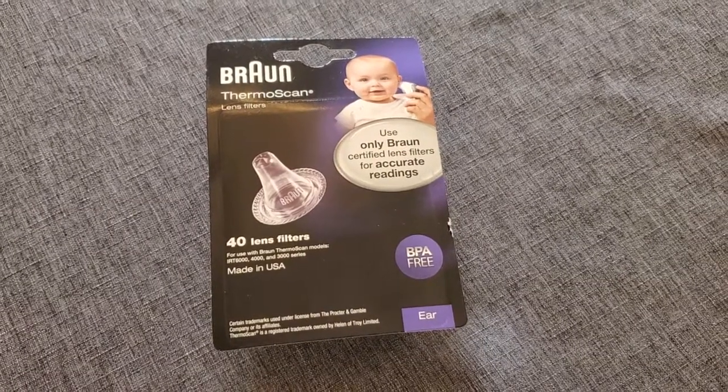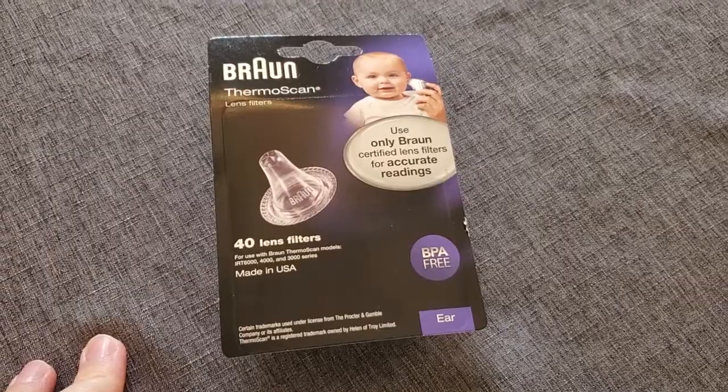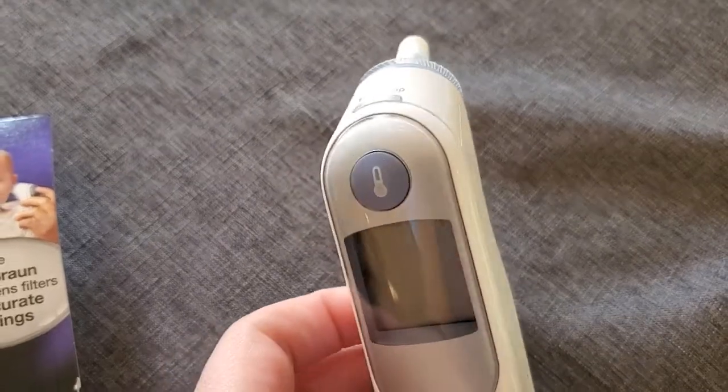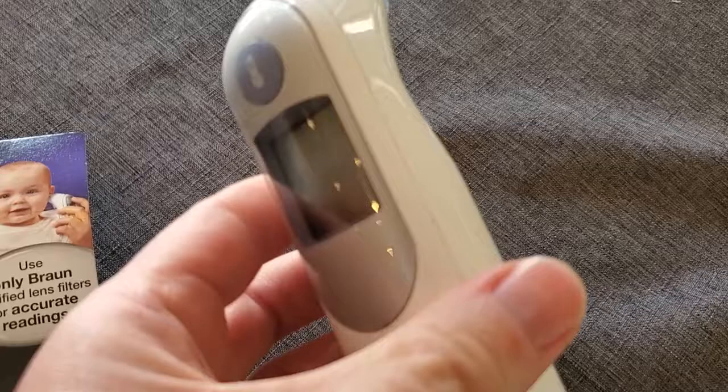I'm Tom from DIY Life Tech, and this is a look at the Braun probe covers for your Braun thermometer. So if you have this Braun thermometer, you know that it's a really great in-ear thermometer, but between uses, you want to put a new probe cover on there for sanitary reasons.